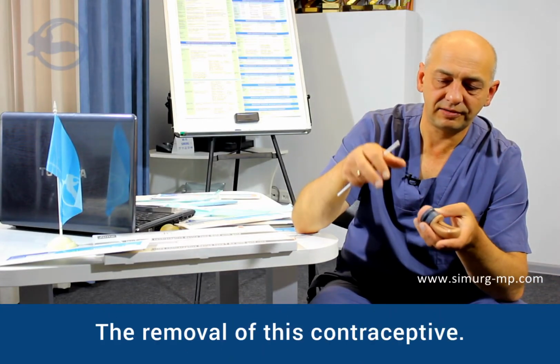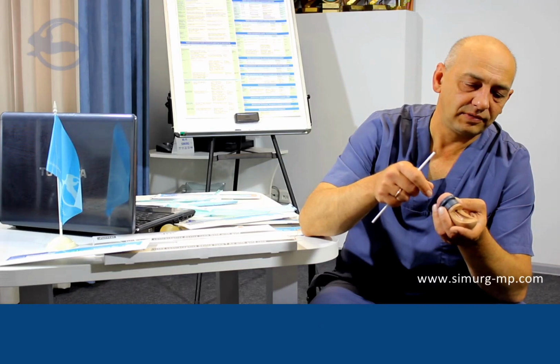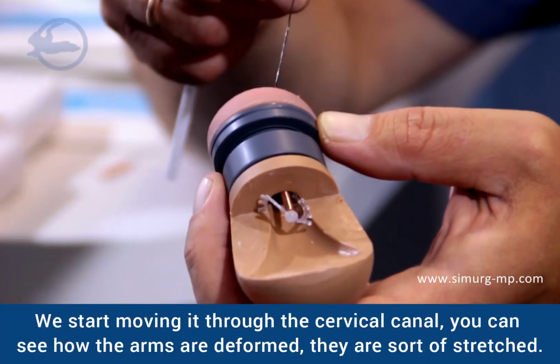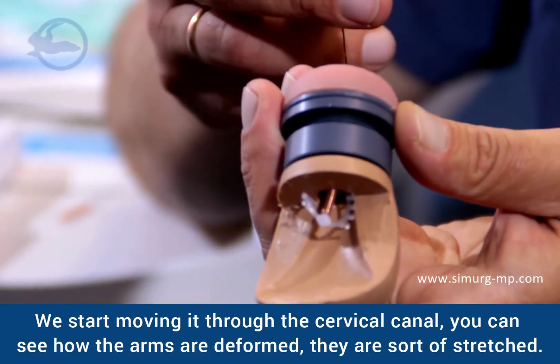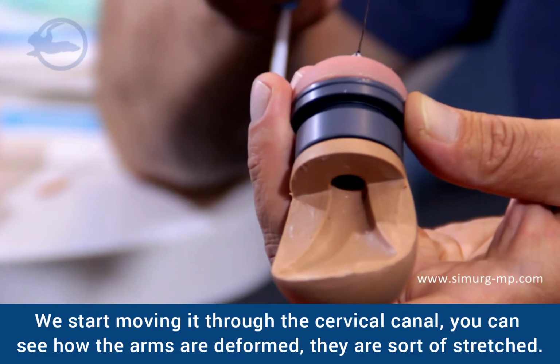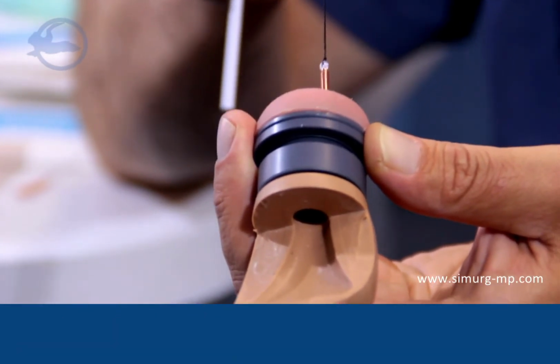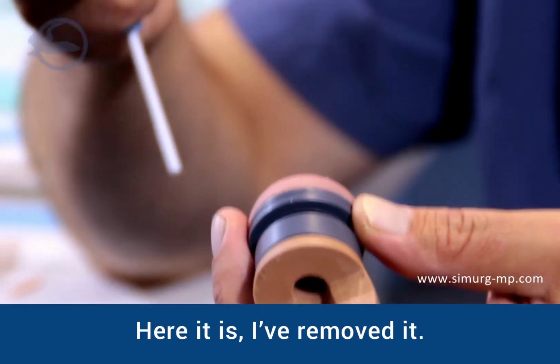The removal of this contraceptive. We start moving it through the cervical canal. You can see how the arms are deformed. They are sort of stretched. Here it is. I've removed it.